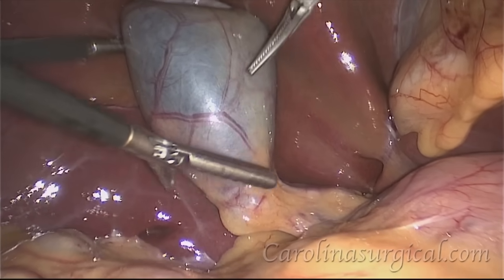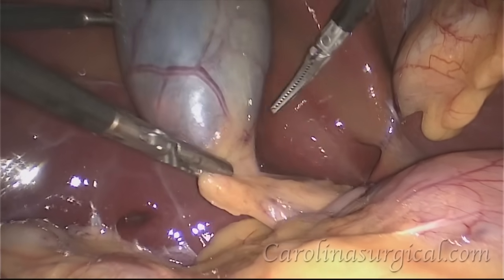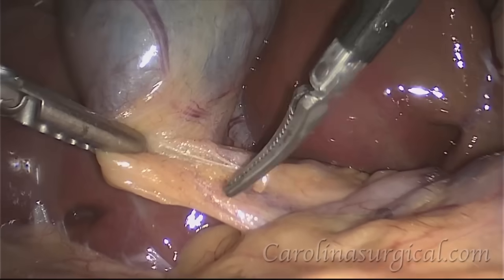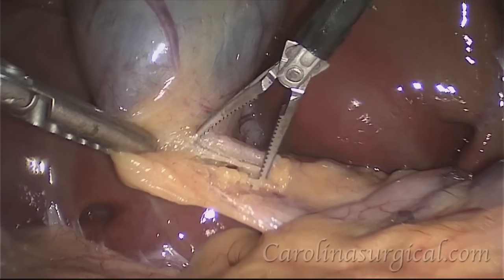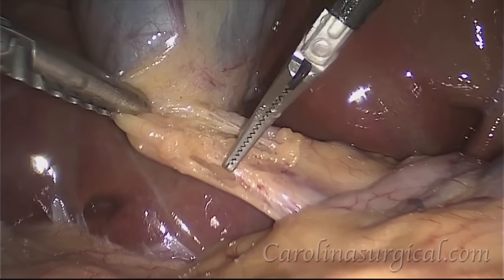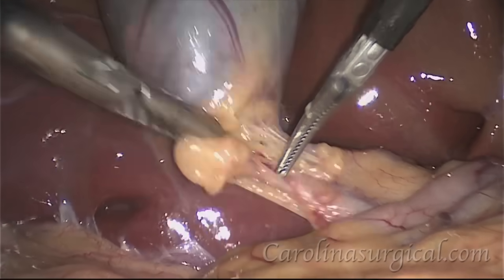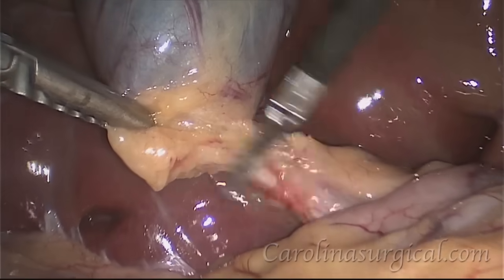We grasp our gallbladder and retract it upward, and you can start to see some of those stones floating around inside the gallbladder. We're going to gently tease away this fat here that's near the cystic duct. The cystic duct is the duct that connects the gallbladder to the main common bile duct, and we just gently tease away that fat until we can see the cystic duct starting to come into view.